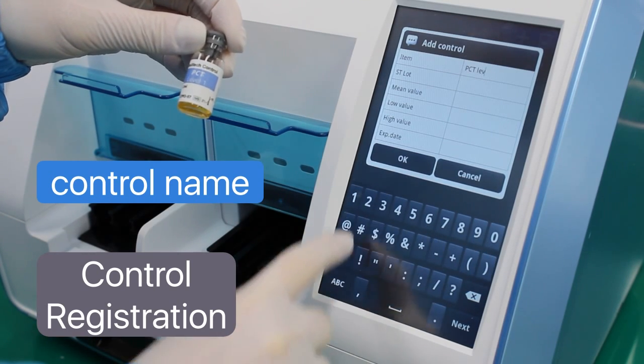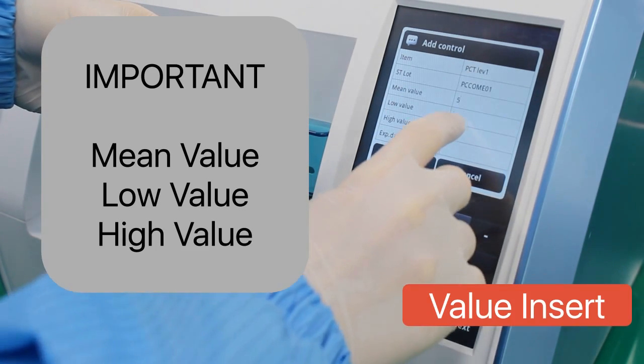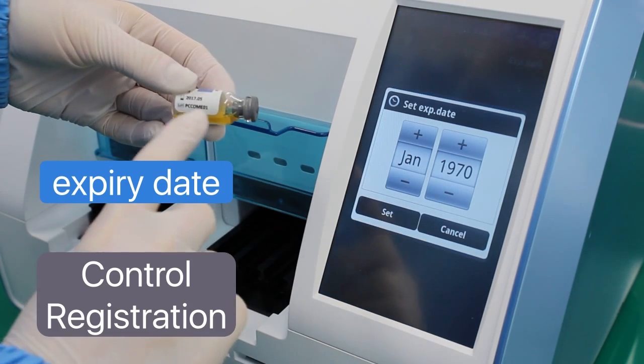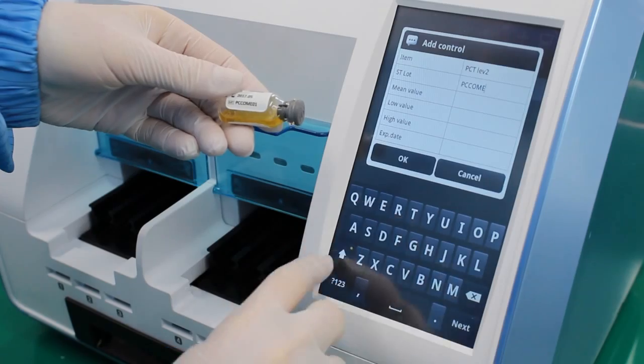All the information needed to register both control levels is indicated on the product label as well as the value insert. In this demonstration, we register PCT level 1 and PCT level 2.